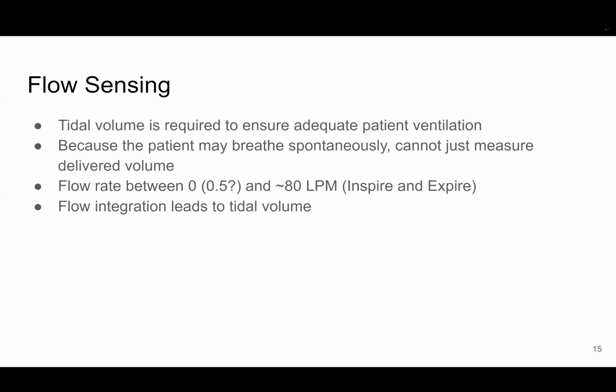I'm going to start, so this is just kind of as a thing we kicked off with in the last day, that this is going to become a larger focus area. So I'm going to type up a better specification that we can start sharing on what we need to accomplish. But just at a high level, we're looking between a flow rate of 0 or maybe as a sensitivity around 0.5 liters per minute would work, depending on what logic we can write in there, and then up to 80 liters a minute for peak expiratory flow.